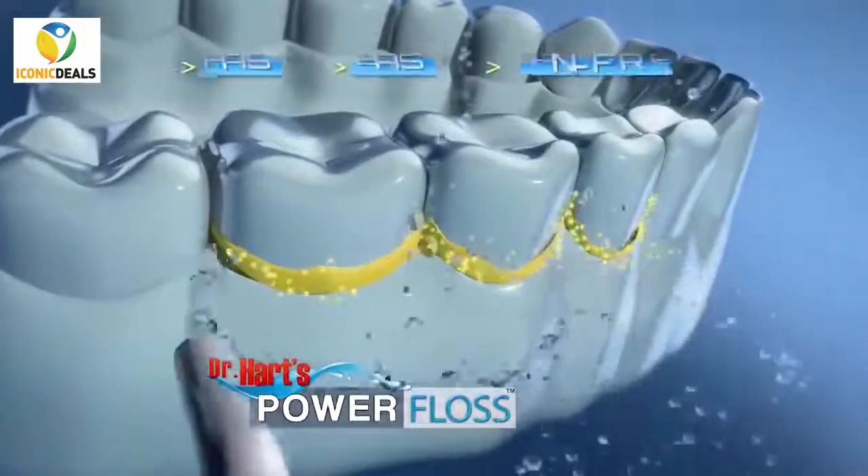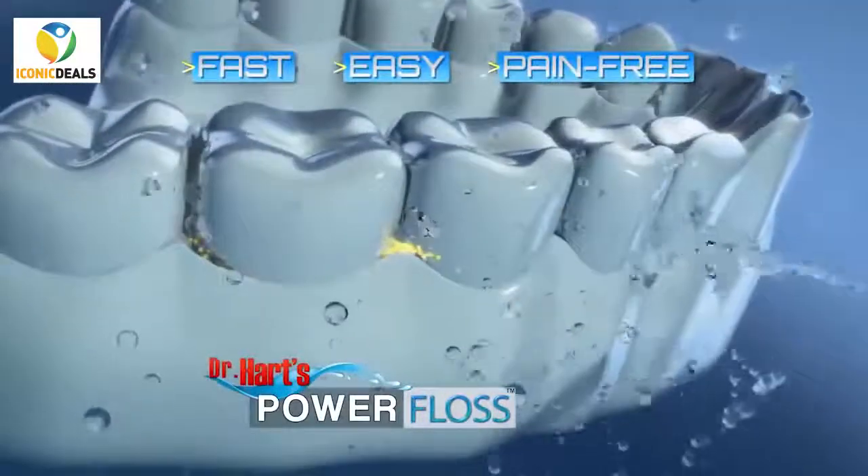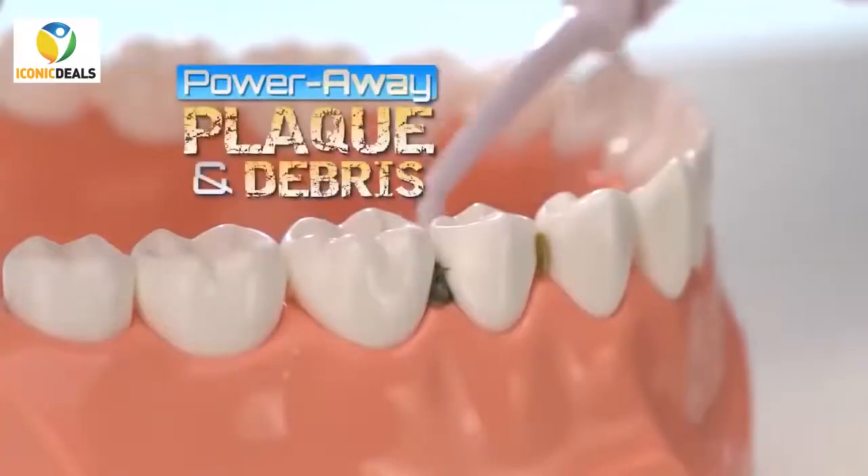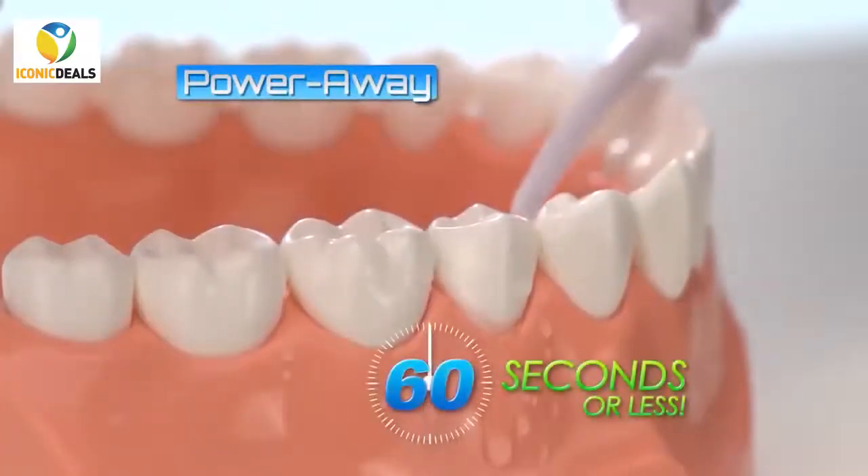Dr. Hart's Power Floss, the fast, easy, pain-free way to floss every day. Just fill, point, and press to power away plaque and debris in 60 seconds or less.